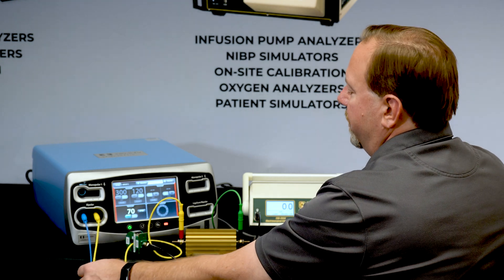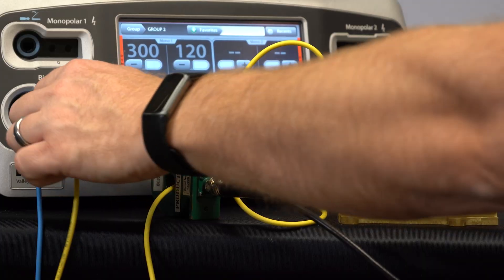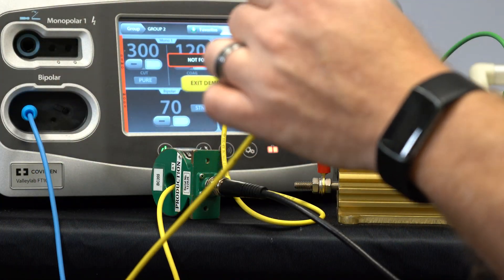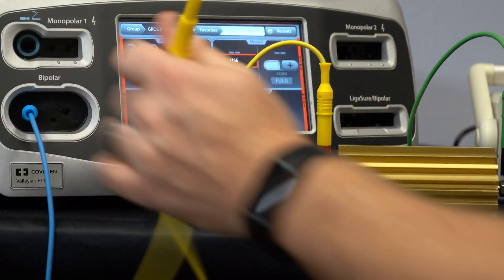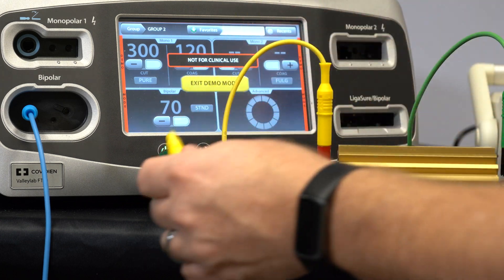The same can be done for a LigaSure. Again we would use our single active electrode through the current transformer to earth ground and take our measurement for a LigaSure or monopolar two.